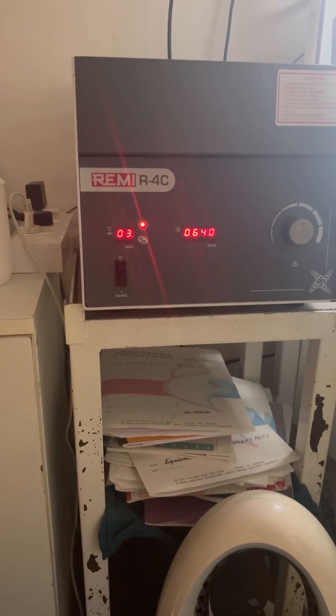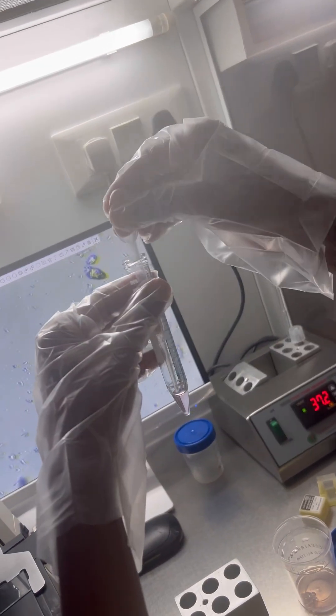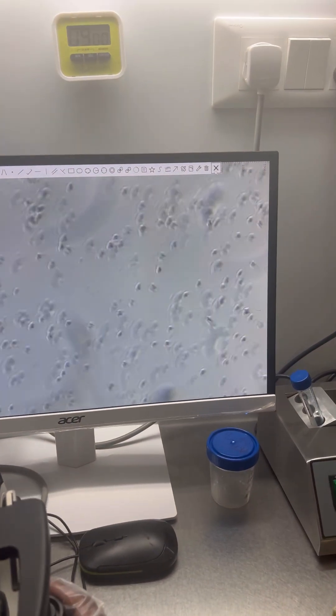The pellet accumulated at the bottom of the test tube is taken out and mixed with the washing media. It is then centrifuged again for three minutes at 650 rpm. After that, the supernatant — the top fluid — is removed, leaving only the bottom portion containing the good sperm. You can see how much difference the processing with these solutions and media makes.